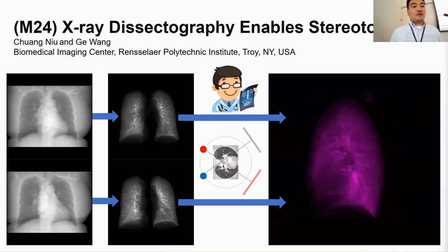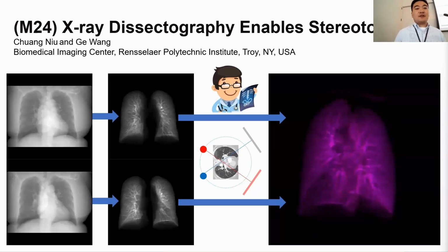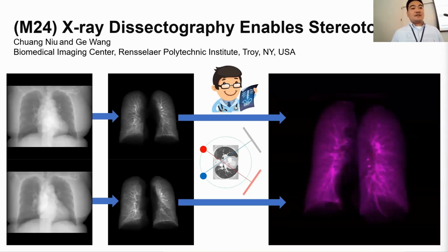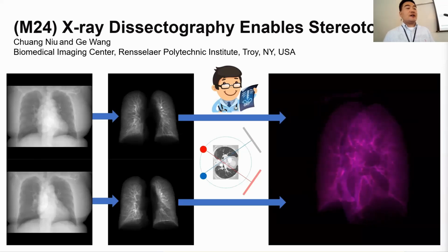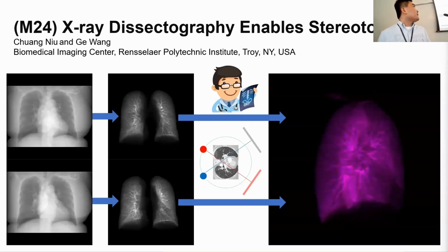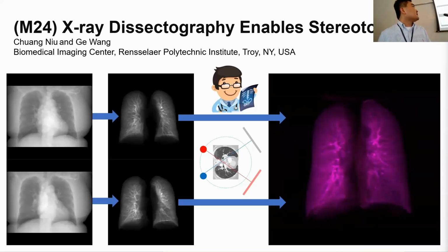In this work, we present a deep learning framework to digitally and collaboratively dissect lungs from few radiographs. And based on this framework, we present a special system to digitally dissect a pair of stereo radiographs. By wearing a pair of 3D glasses, we can see the 3D lungs.